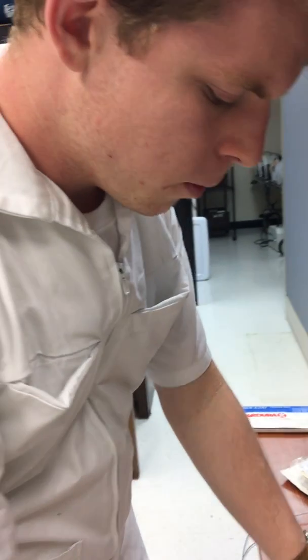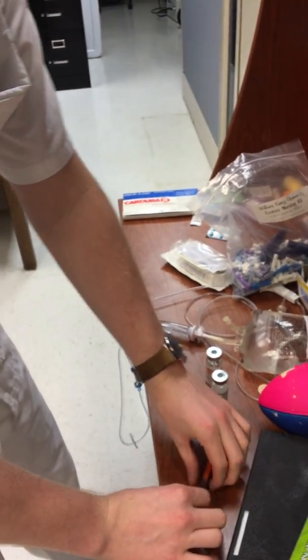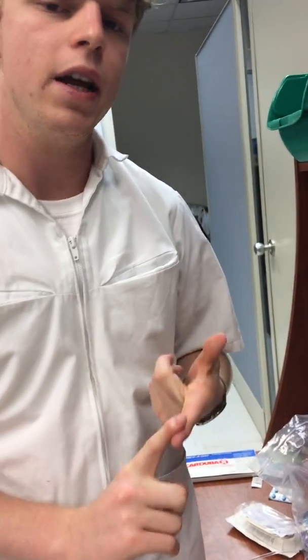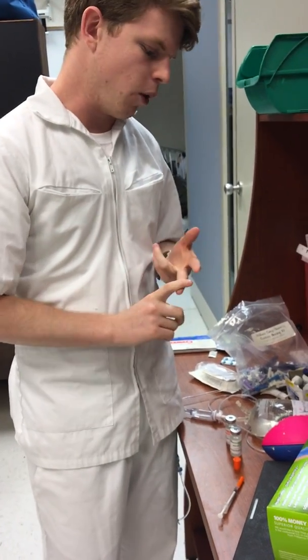I would make sure to label my insulin syringe before I go into the patient's room so that I don't get anything mixed up. I would take it into the patient's room and put on clean gloves and do hand hygiene. Again, verify the patient with their name and their date of birth, and verify that I have the correct type and amount of insulin with my MAR.